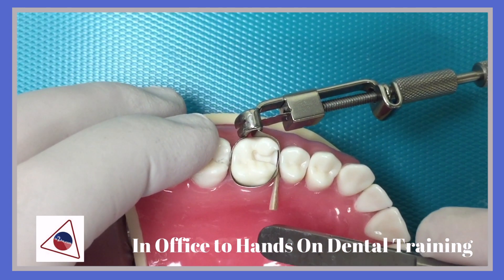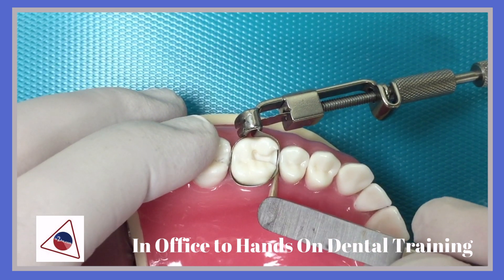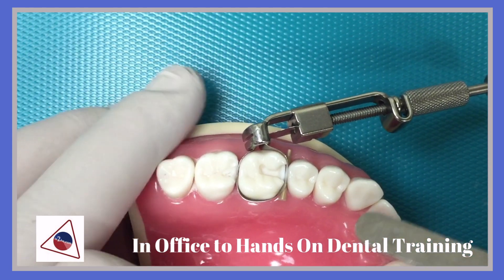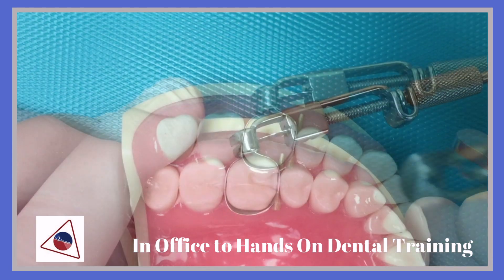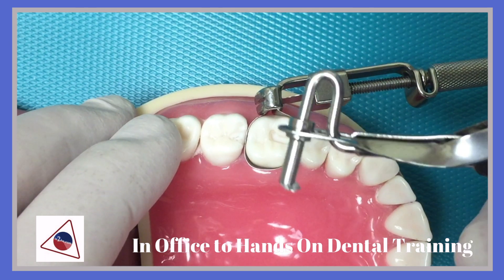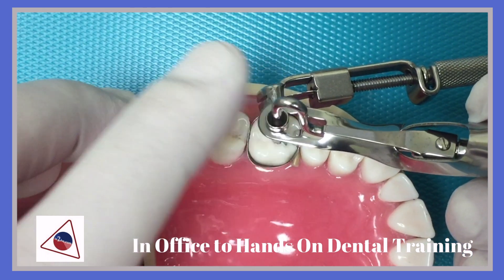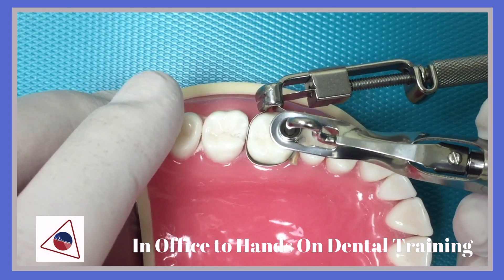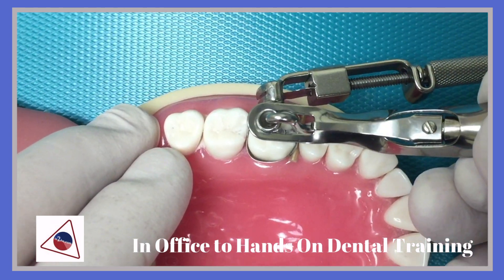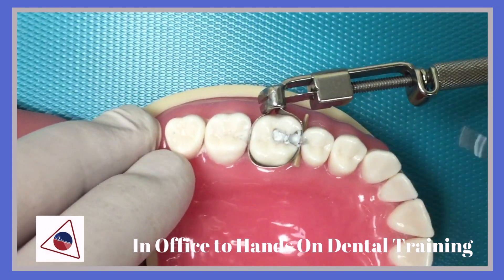The wedge will help secure the gingival portion of the matrix band, and from here you are ready to condense amalgam. A very important technique would be to start in the box form, and being able to adapt the material into the gingival margins and also the occlusal margins of the prep.